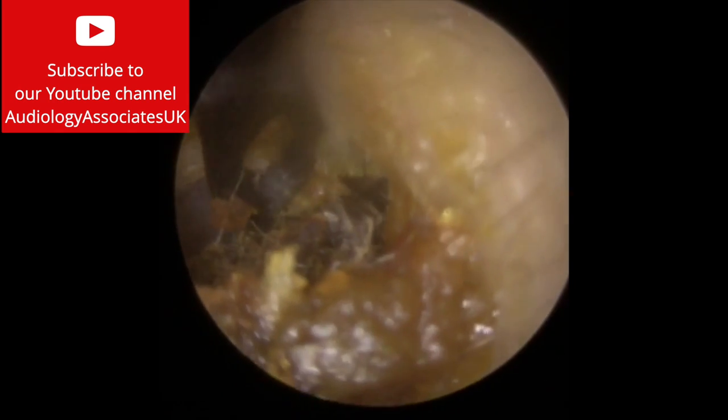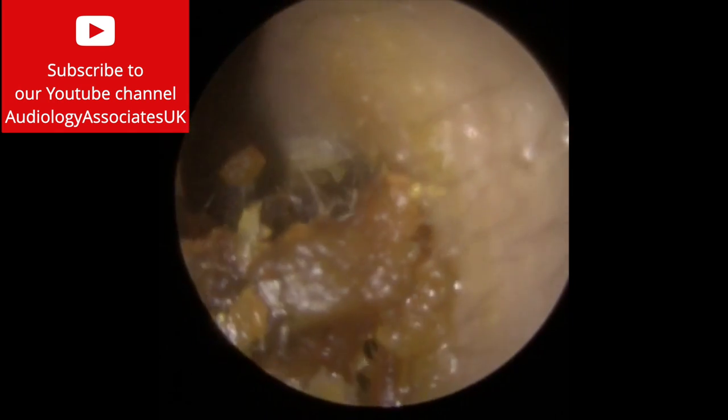So we're just using the Jobson horn now just to try and get behind it. What I could see when I first looked in with the Jobson horn was a leading edge, so we thought we could get behind it and bring this forwards, which is what you can see us doing here. But I can see that this is a really long piece of wax — I can see it disappearing down into the canal. So what I need to do first is manoeuvre it so that the front end is facing towards the outer part of the ear canal, which we've done.